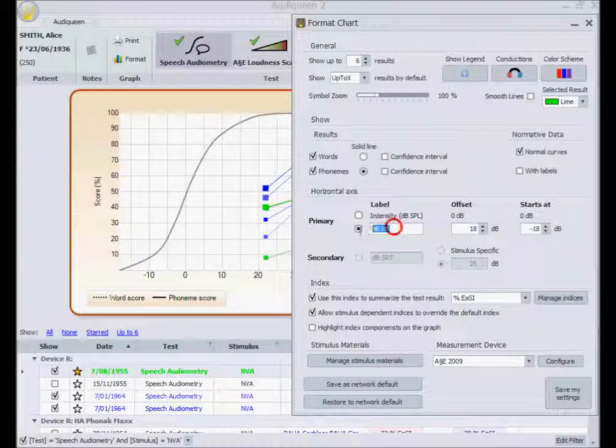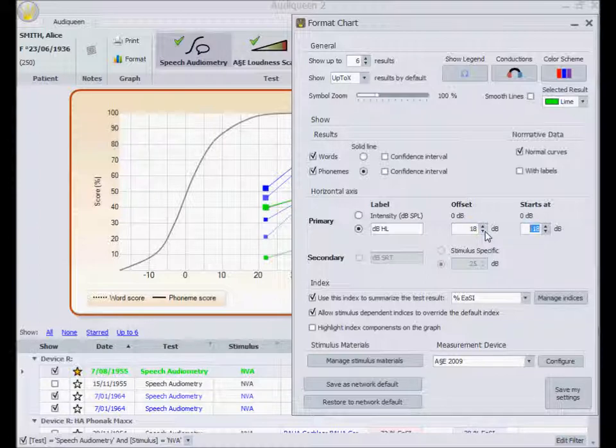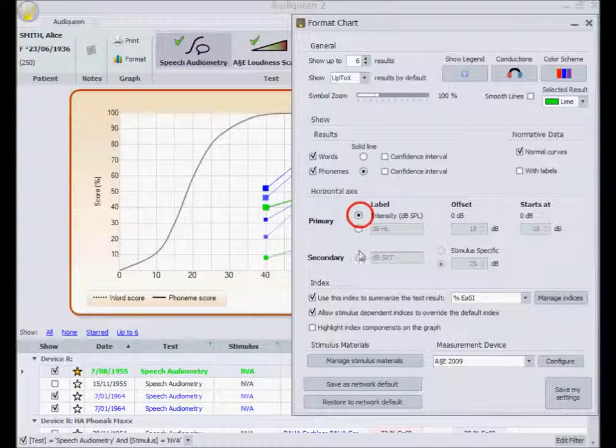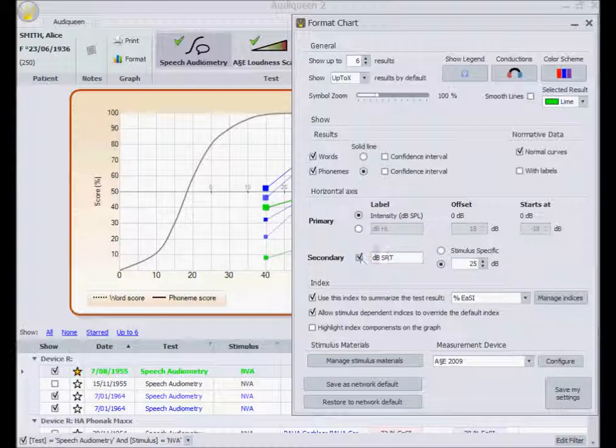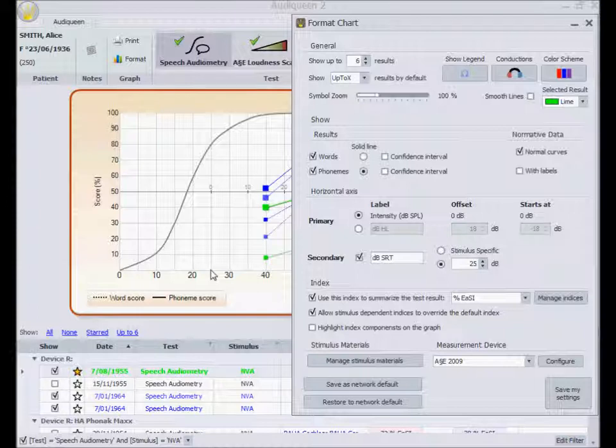I can change the scale of the horizontal axis from dB SPL to any other scale. I can add a second horizontal scale, for instance, the speech reception threshold, or SRT scale. And I can set this at a fixed level or make it relative to the normal curve that comes with this specific speech material.